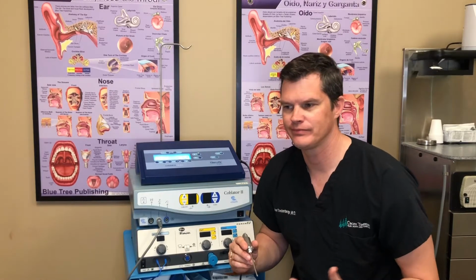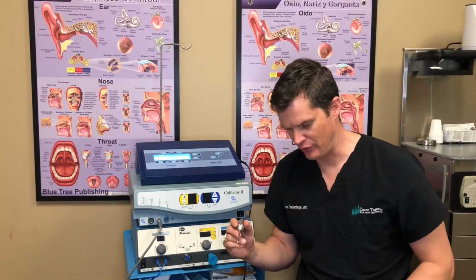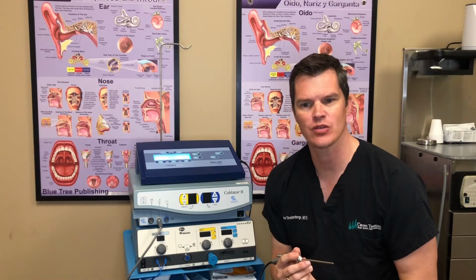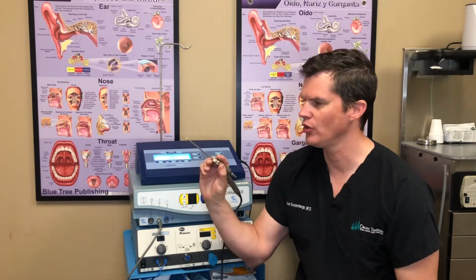So, I've just kind of gotten on a kick of showing the different tools that we have around to manage sinus and nasal problems. And so this is what's called a microdebrider. And I'll bring it up to the screen here in just a second.